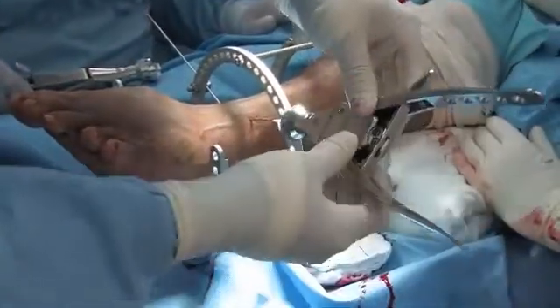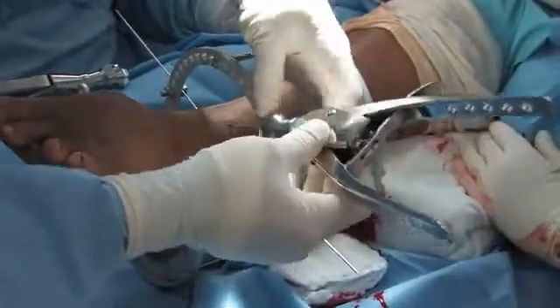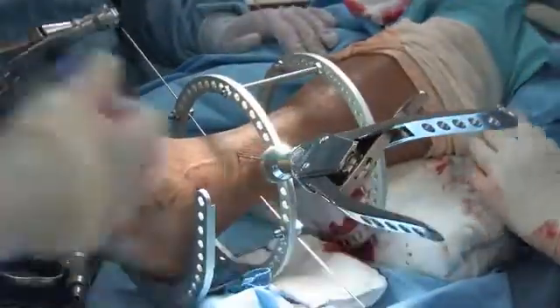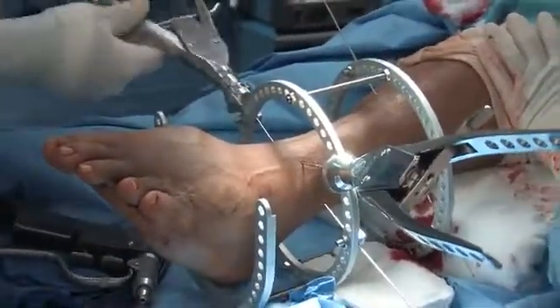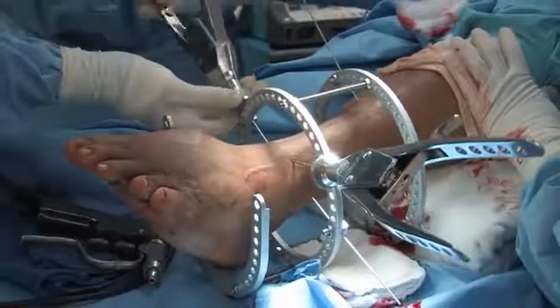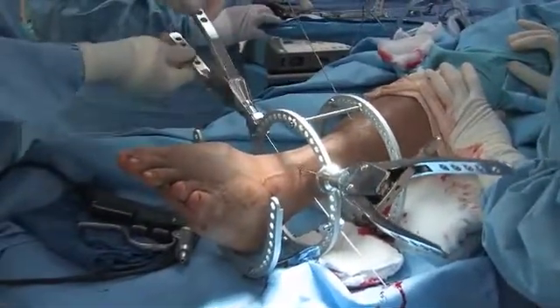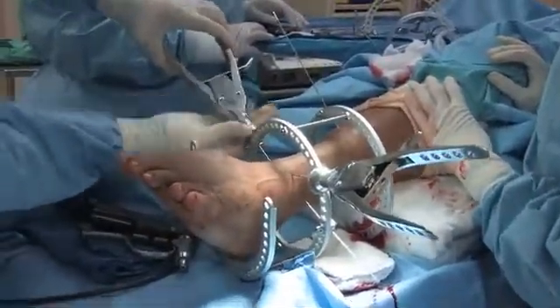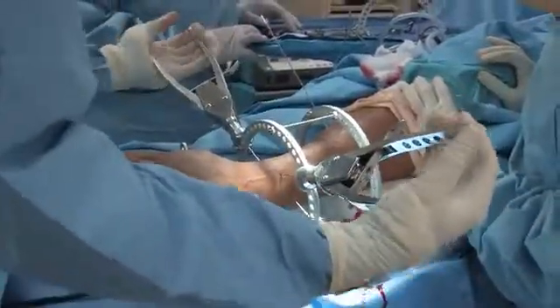The idea here is you open up the tensioner all the way. You'll slide that down over the wire you're going to tension, turn that onto the head, and then I usually will put 1 or 2 clamps just to hold the wire. Go to the other side, same scenario. What we want to do is tension these simultaneously to approximately 120, 130 kilograms. So I'm going to turn then face these numbers where I can see them. And then simultaneously we're going to go ahead and compress.